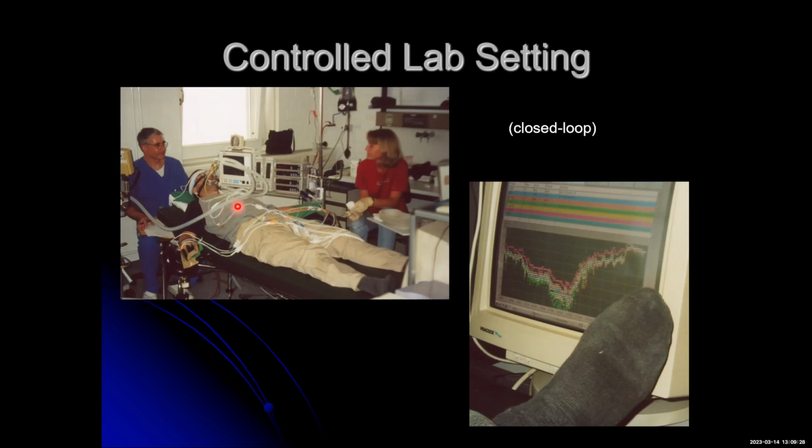And this is a desaturation setup. So you see something that maybe you haven't understood or appreciated before, but there's a variety of instruments right there to make sure that the subject is safe. So heart rate, blood pressure, those sort of variables are there as vital signs so you don't harm the subject. But more importantly, you're there to collect data. So there's lots of cables going to multiple pulse oximeters, and you can see the displays here. And that plateau event is what you see there on that old CRT monitor.